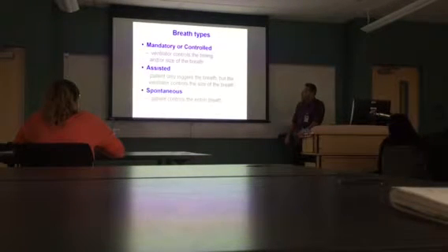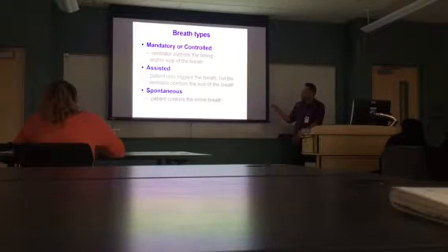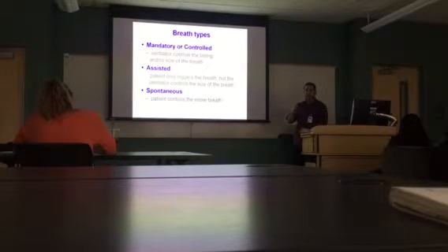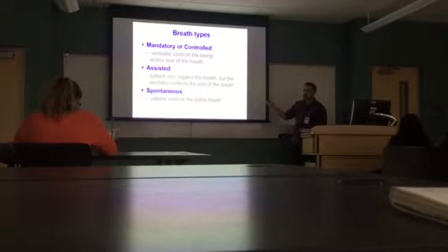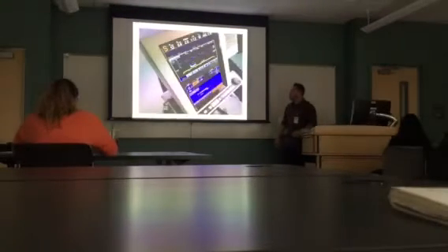So here's some of the terminology that you might have heard: mandatory or controlled. The ventilator controls everything. Assisted means that the patient only triggers the breath, but the ventilator controls everything thereafter, right? And then spontaneous, the patient is the one in full control. So remember that one mode I told you, AC, assist control? If the patient wants to trigger, he gets a breath. If he doesn't want to trigger because he's too sick and he's apneic or sedated or paralyzed, then he gets controlled. And then the patient that's about to be extubated, he's spontaneous. He's breathing on his own.